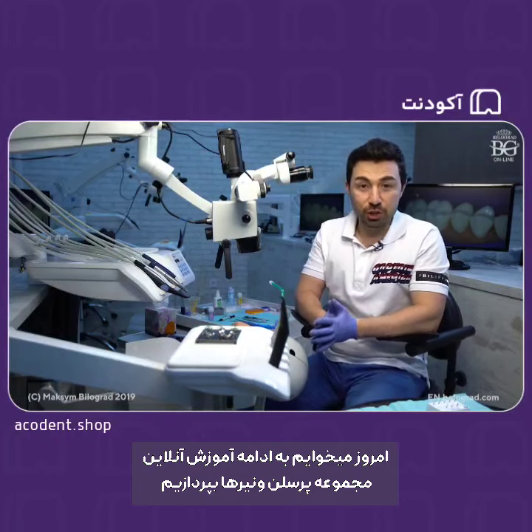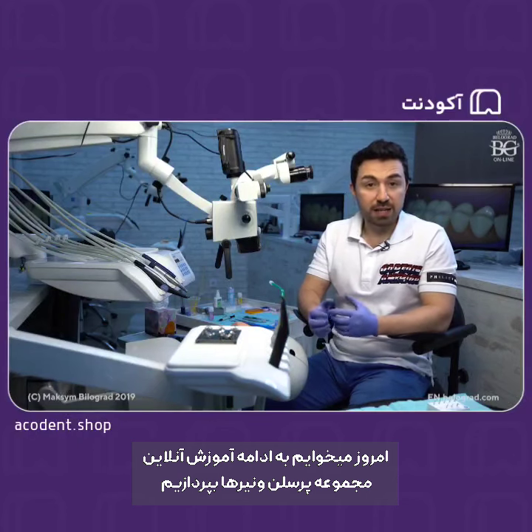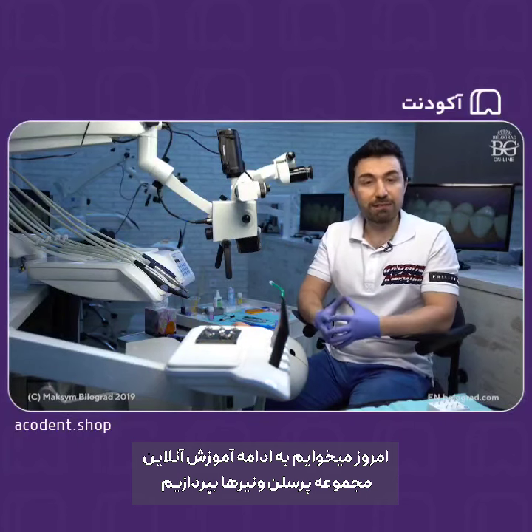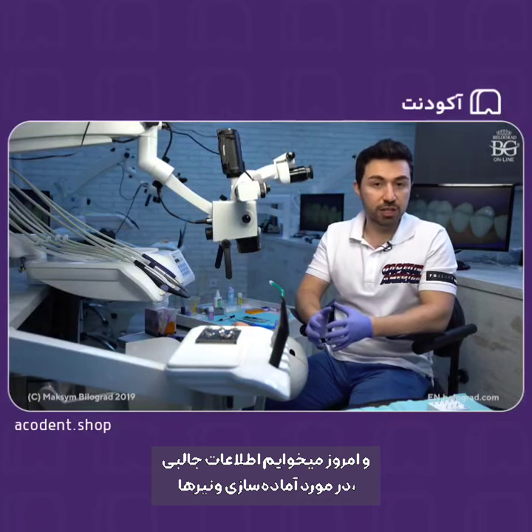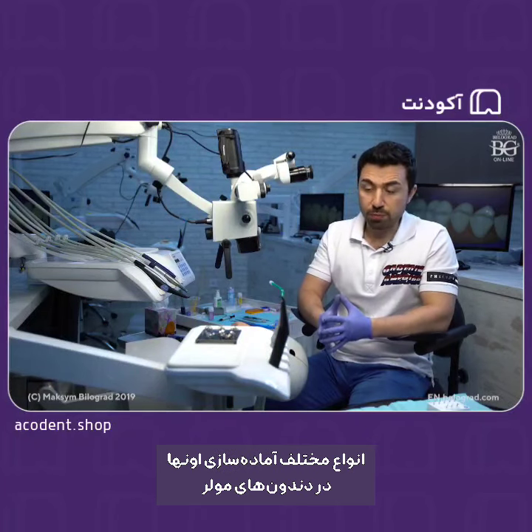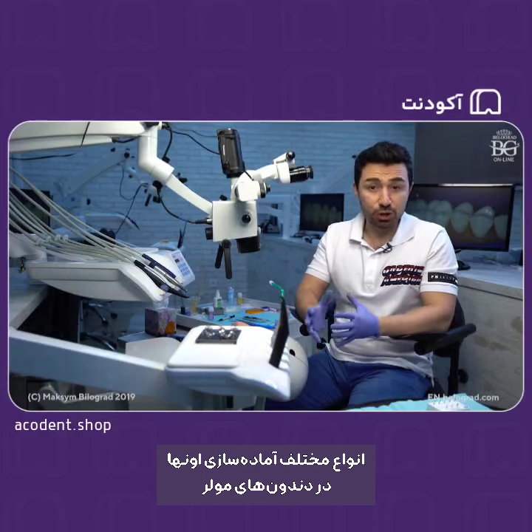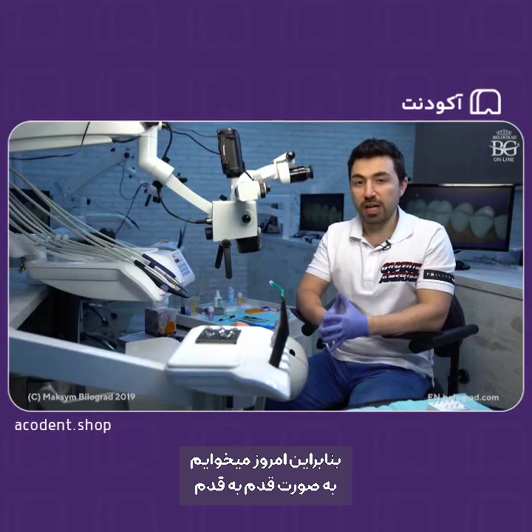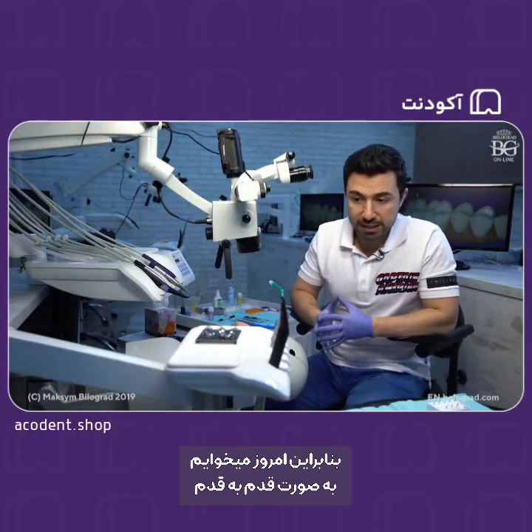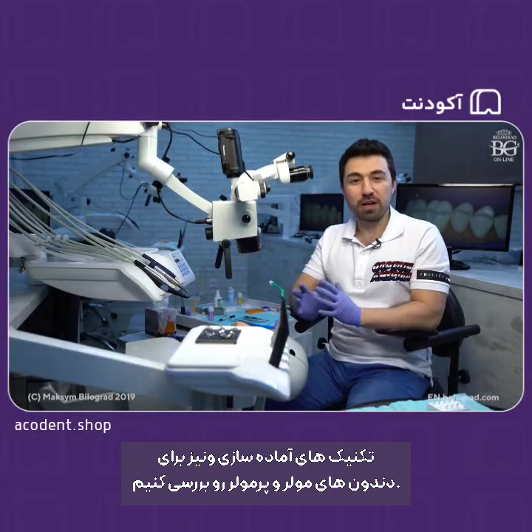This time we continue our online masterclass series dedicated to porcelain veneers, and we decided to provide you a really interesting and discussable topic about veneer preparation: different types of veneer preparation when the case comes to molar and premolar teeth. So basically, we will be discussing today and showing you step-by-step techniques to prep veneers for molars and for premolars.